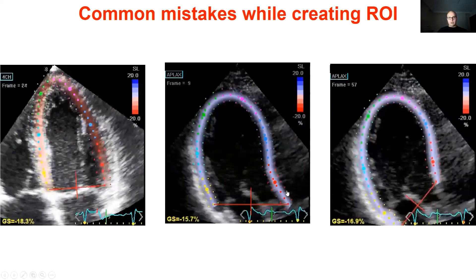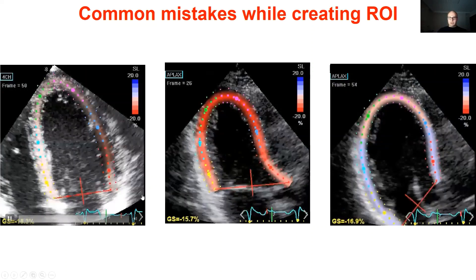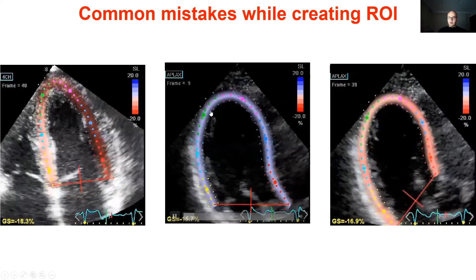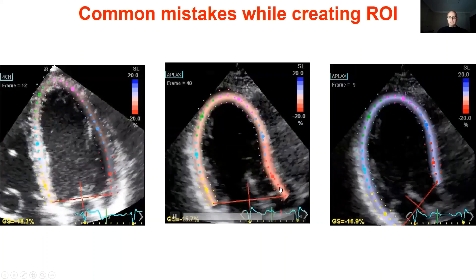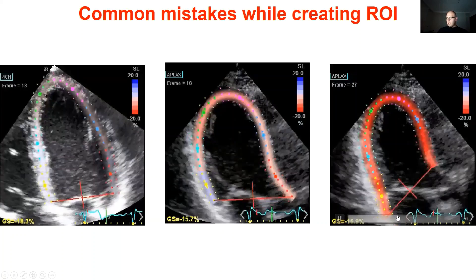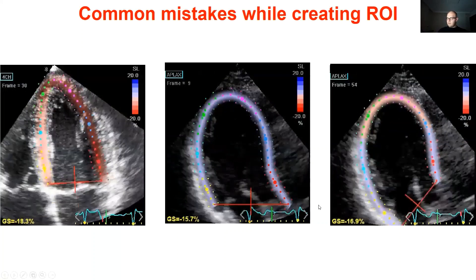I want to show some examples of common mistakes while creating the region of interest. Detection of reference anatomical structures is really important. In the first image, the region of interest is exceeding the apical epicardium, which is wrong. In the middle image, tracing of the anteroseptum is wrong and should not extend into the LVOT. In the third image, there is an example of inappropriate tracking of the mitral annulus. The mitral annulus should be identified properly and the region of interest should not exceed the insertion of the mitral valve leaflets.